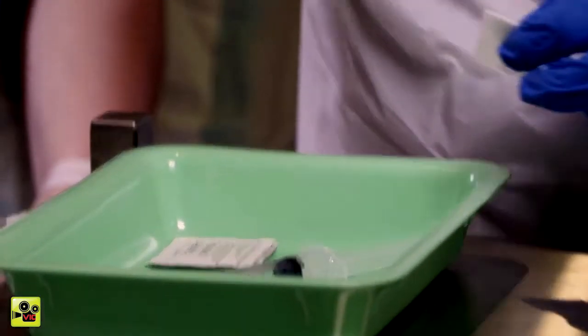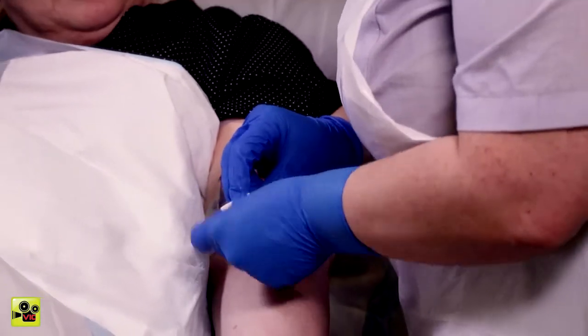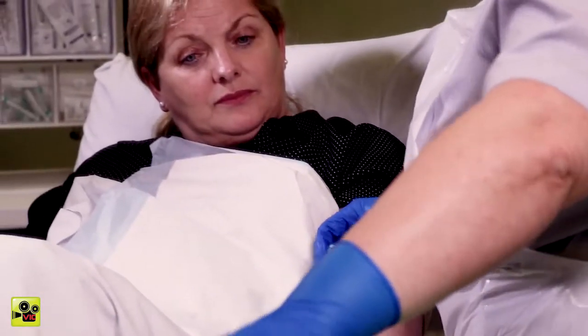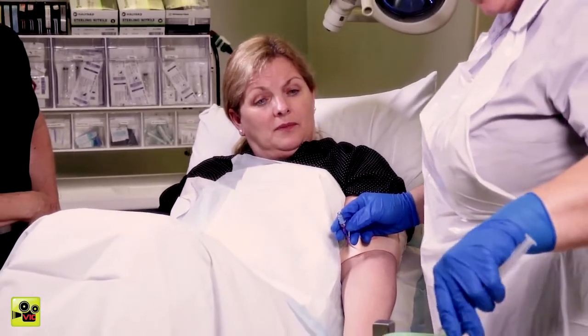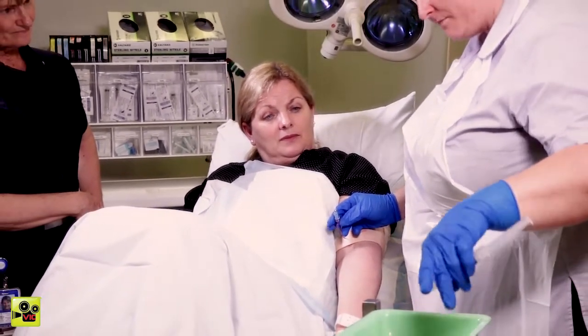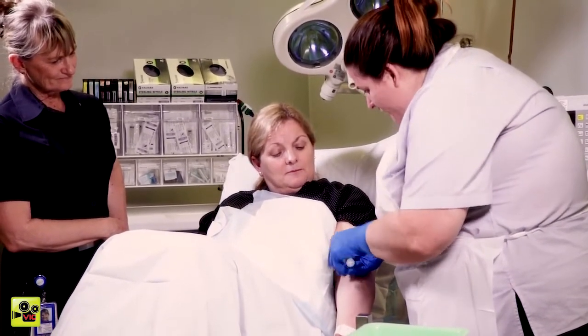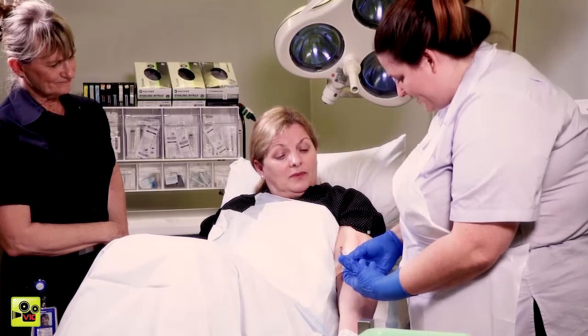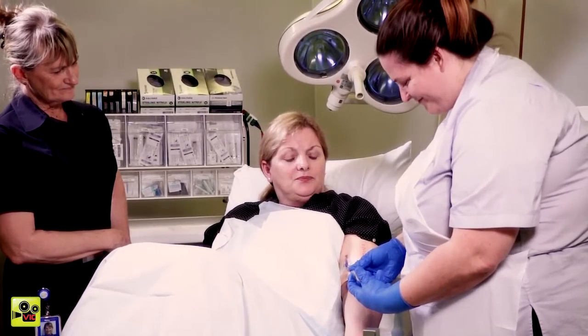I've changed the bung, now I'm just going to give the line a flush. So I'm just going to give it a little clean and then we just need to let it dry. It's just a second. Alrighty. So I'm just going to flush it with some salty water. You might feel a little bit of coldness. That's normal. Oh yeah, it's just a little bit cold.